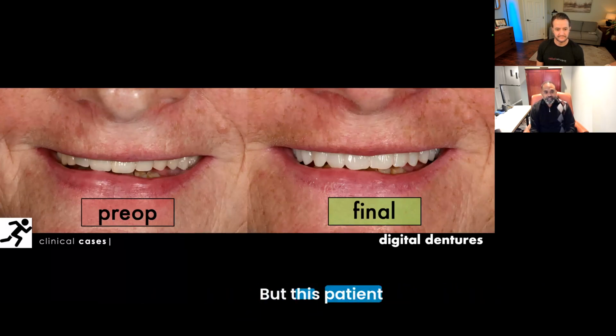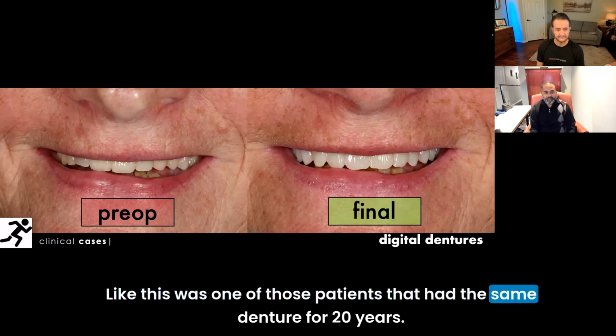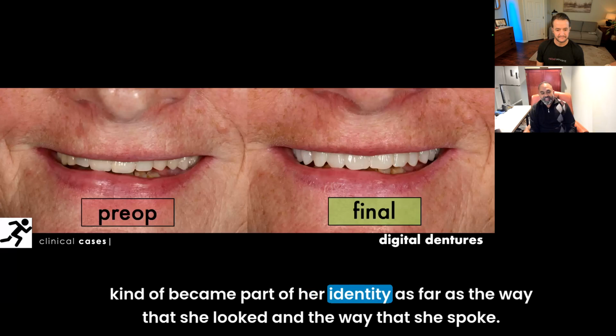But this patient, if you see the pre-op photo on the left, had this existing complete upper denture for many years. Like, this was one of those patients that had the same denture for 20 years. She's probably in her late 50s, and she lost a lot of teeth, and so she's been wearing this same one, and it really kind of became part of her identity as far as the way that she looked and the way that she spoke.